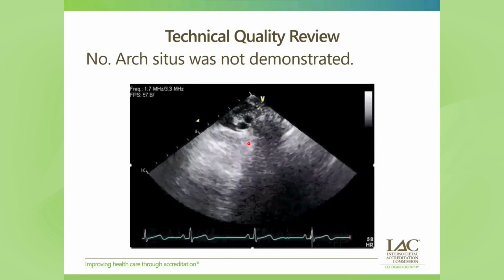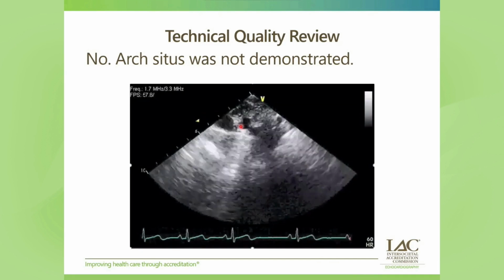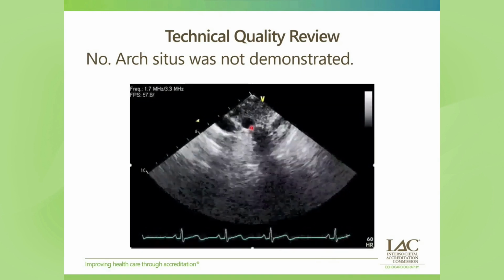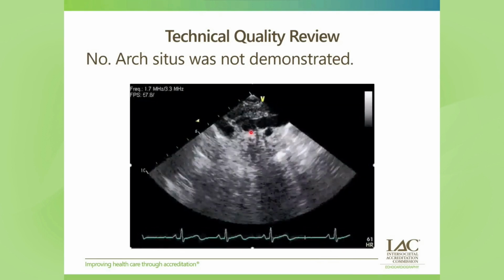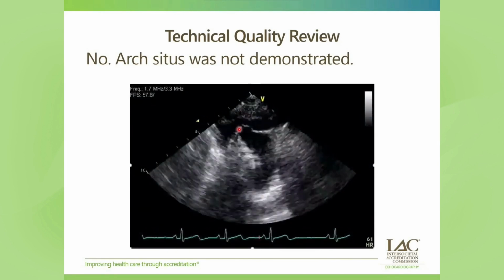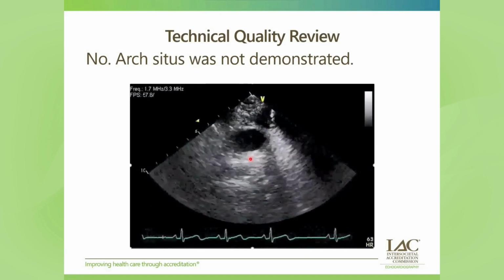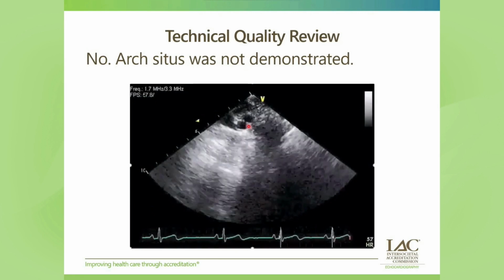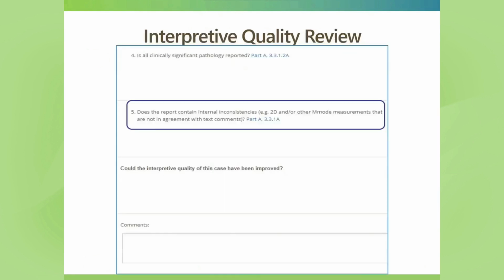And you're going to follow the course and branching of the first vessel that arises from the aorta. So this one right here, and you see it goes off to the patient's right and breaks into 2. I know it goes a little fast, off to the right side of the patient and breaks into 2 vessels. So that is our brachiocephalic artery going into the subclavian and the right carotid. So we know that the arch is pointing to the left of the patient. So this is a left aortic arch with normal branching. And this is how we demonstrated arch-sidedness.